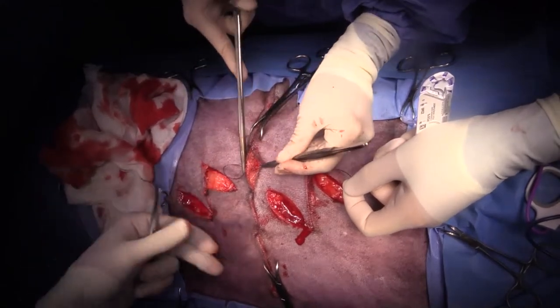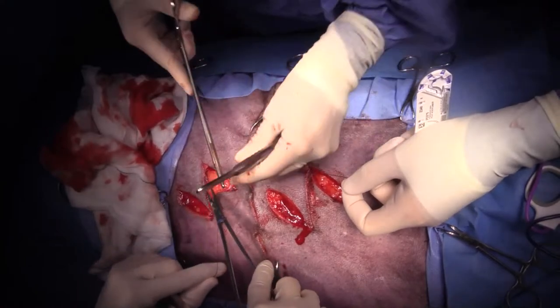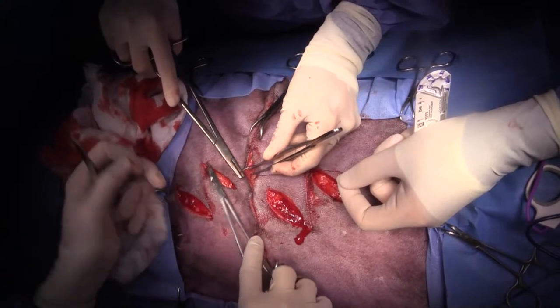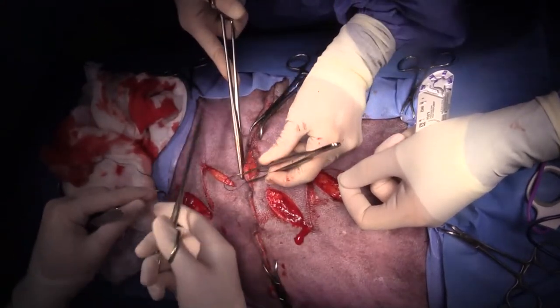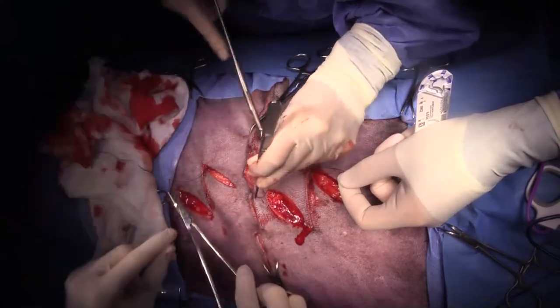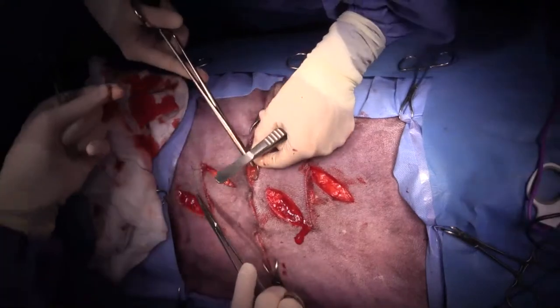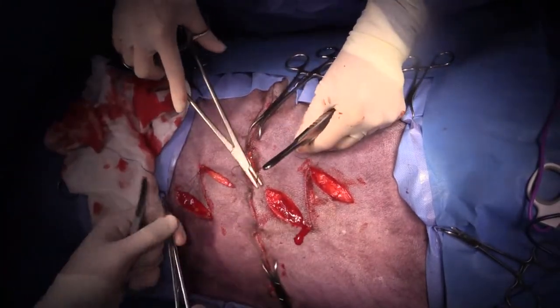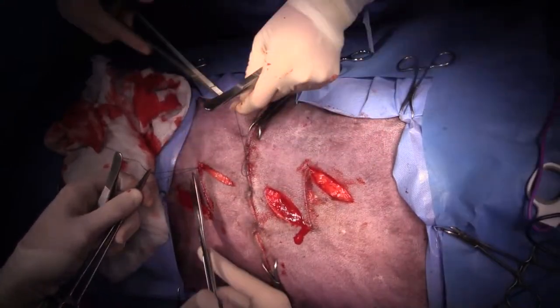All right, so I'm going to leave these guys to it. So basically the rest is just intradermal closure and some skin sutures in the middle of the incision. So quick and dirty, H-plasty is a consideration. That probably would have worked as well, just given us a little bit of mobility. I really like the Z. The H works well as well.